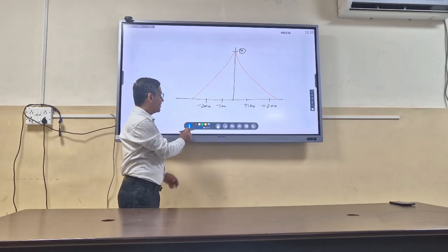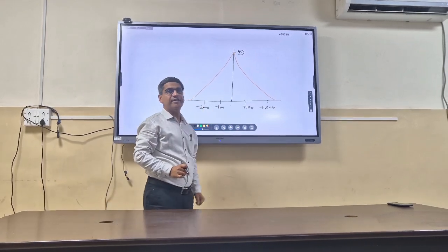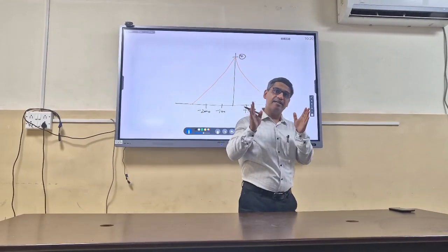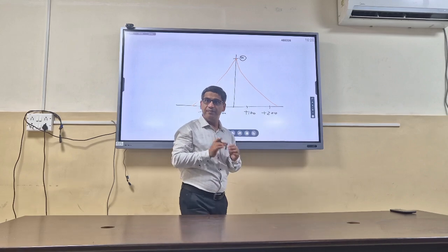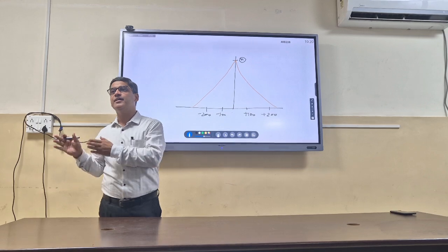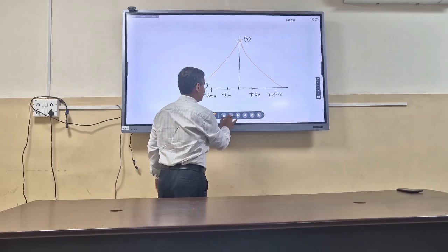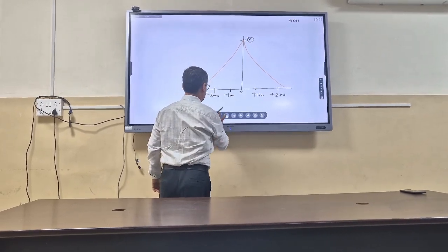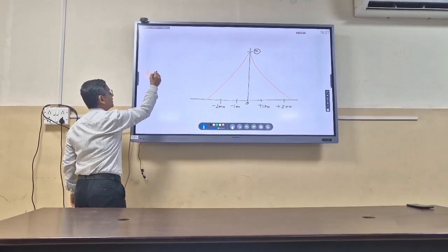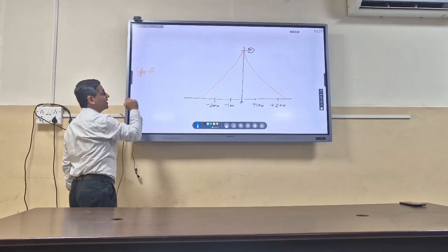If we get this type of graph of normal compliance at 0 millimeter of pressure, it means that maximum compliance is at ambient air pressure. It means the eustachian tube function is normal, so that it is able to equilibrate the middle ear pressure with that of the atmosphere. So this is called type A. Is it visible or should I use a different color? It is visible. It is called type A.